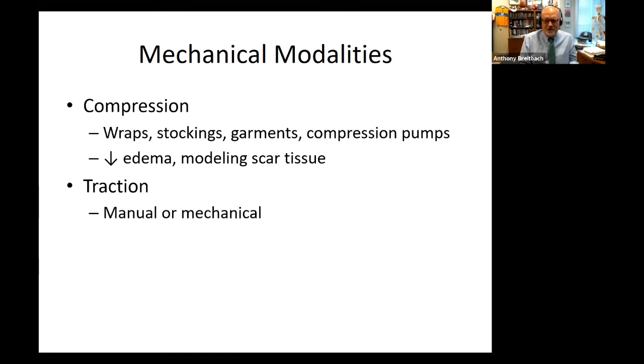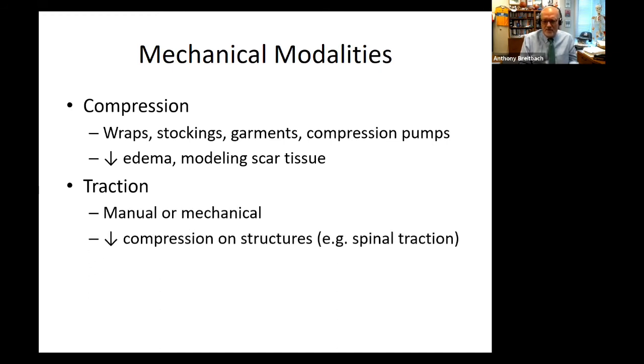Traction can either be done manually or mechanically, and hopefully what we do with traction is decrease compression on structures, for example with spinal traction. We also use it in some areas of the extremities, but really for the most part, most of the time we'll use it as either cervical or lumbar traction.